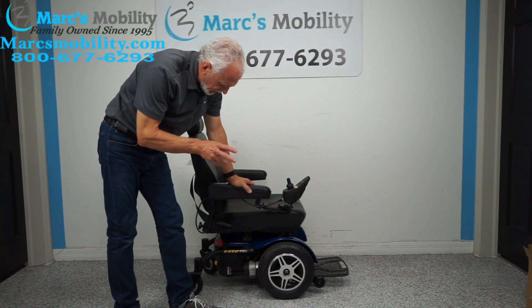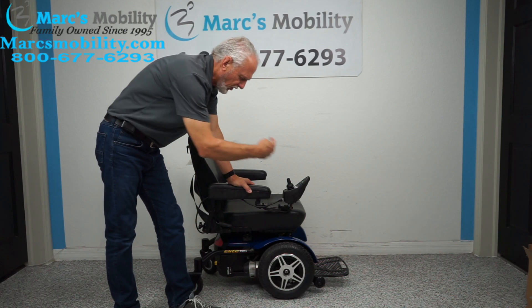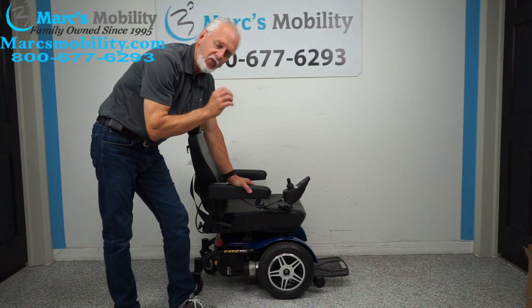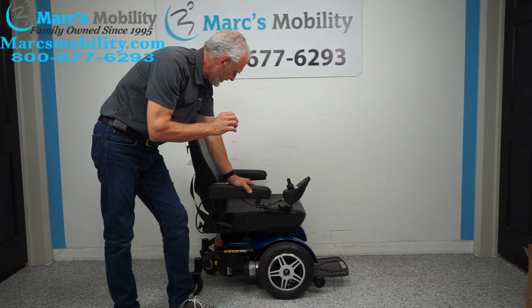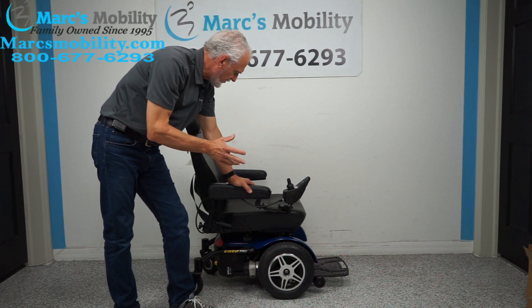What we have here is called a Jazzy Elite HD. This is a front wheel drive power chair with a 450 pound weight capability. This power chair was used for about 4 or 5 months, so it's practically new still.